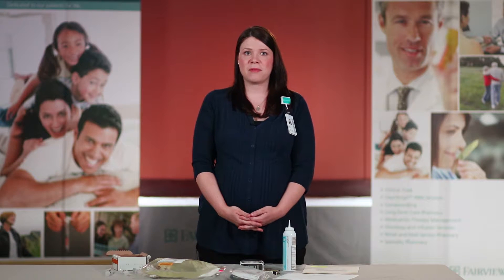Hi, I'm Sarah Peterson. I'm a registered nurse with Fairview Home Infusion. I will be discussing how to infuse your total parenteral nutrition for today.